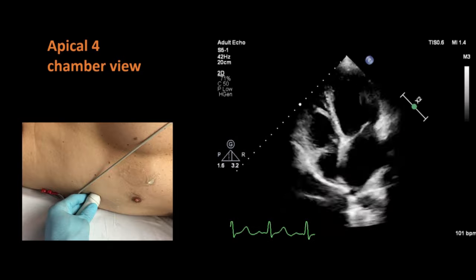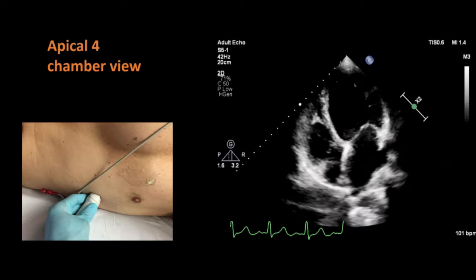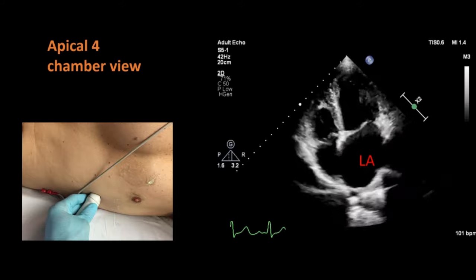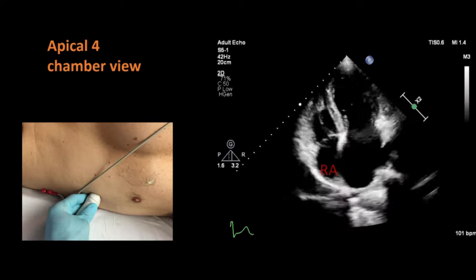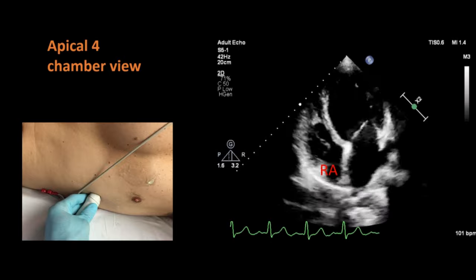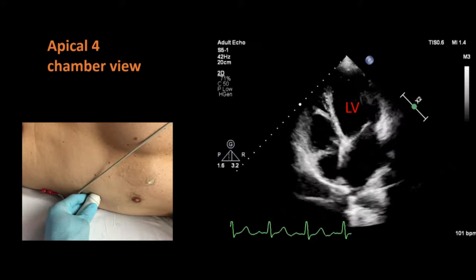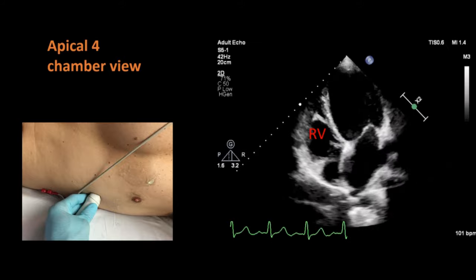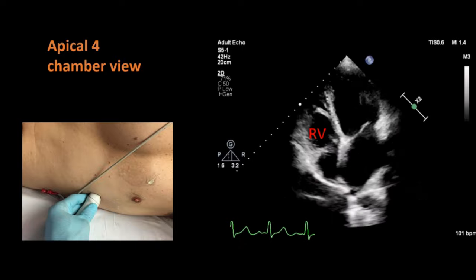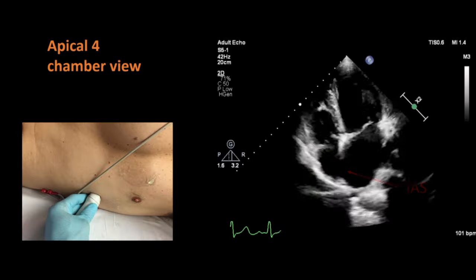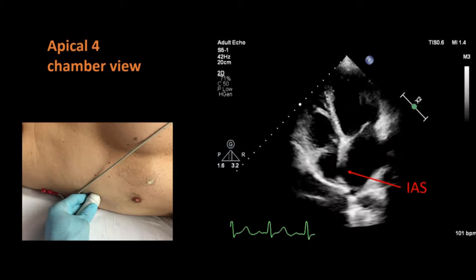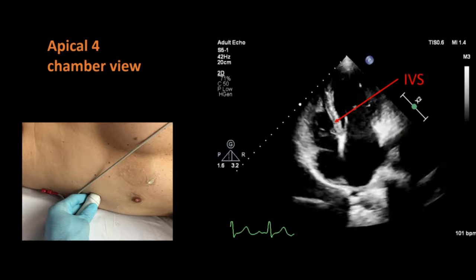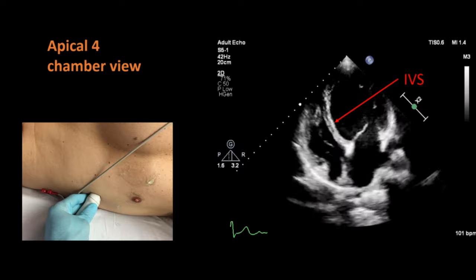In the apical 4-chamber view, as the name suggests, we can see all four chambers of the heart. This is the left atrium, then the right atrium, this is the left ventricle, and here is the right ventricle. The inter-atrial septum separates the right and left atria, whereas the interventricular septum separates both ventricles.